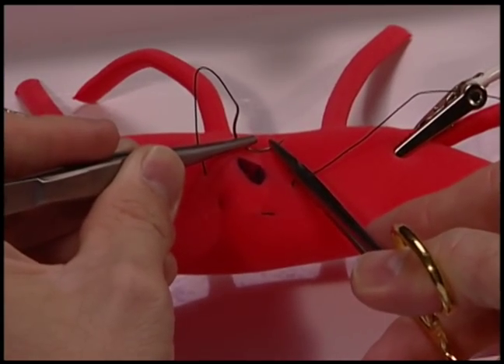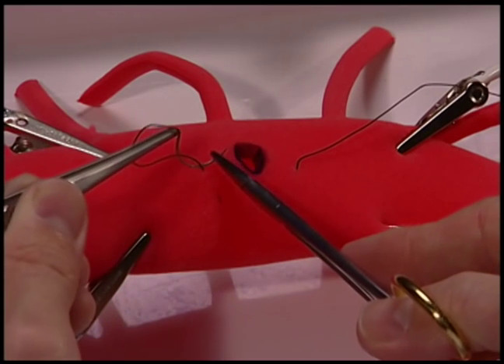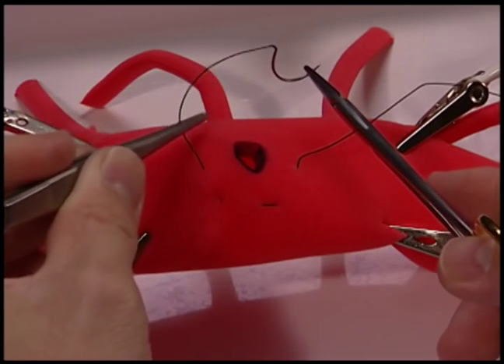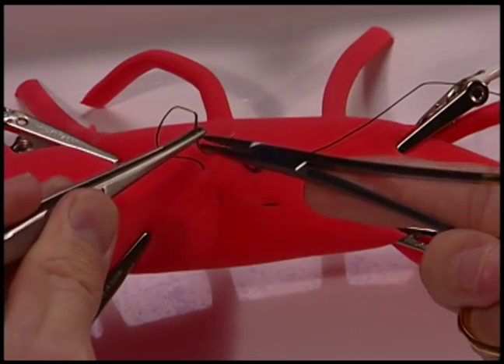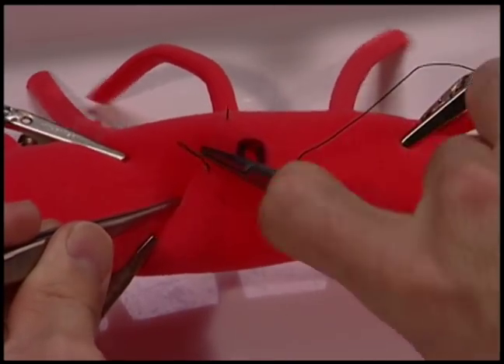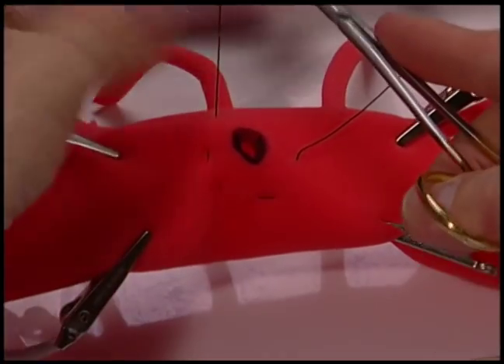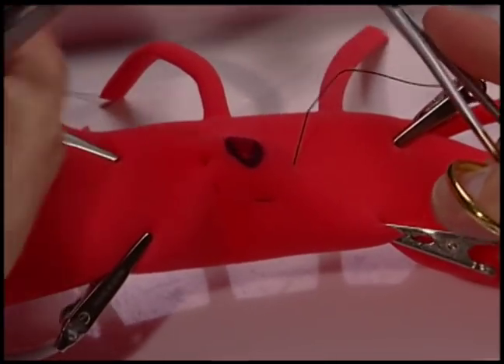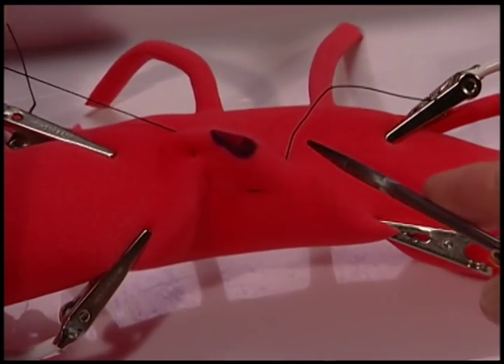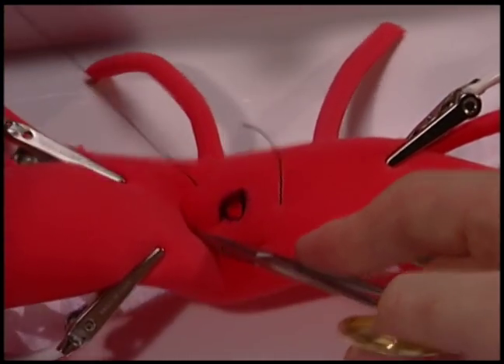Another common error is to forget to draw the suture through the purse string as you go. This ends up leaving a very short amount of suture left, making it difficult to place additional sutures as you come around the purse string, and eventually forces you to drag the suture all the way through the tissue, potentially stressing the tissue. It's much better to bring the suture through with you with each bite.